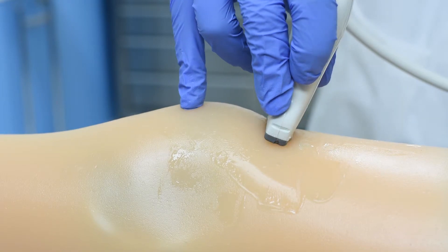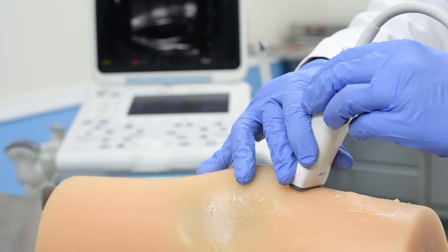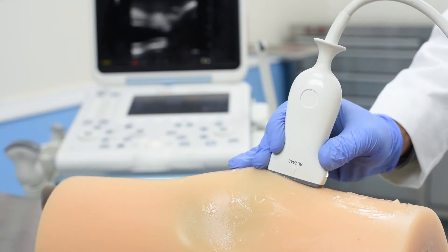The model contains the distal femur, proximal tibia and fibula, patella, quadriceps tendon, femoral fat pad, quadriceps fat pad, bursa, and the joint capsule. All of the anatomy allows you to accurately practice the lateral mid-patellar approach for ultrasound-guided knee injection.